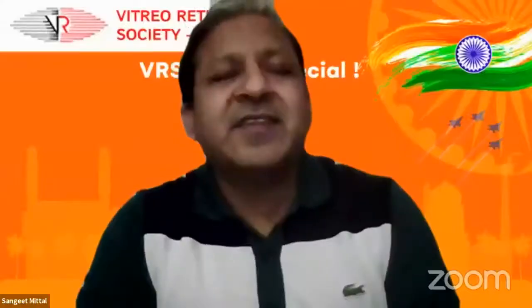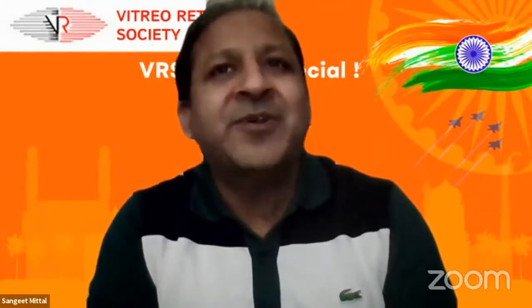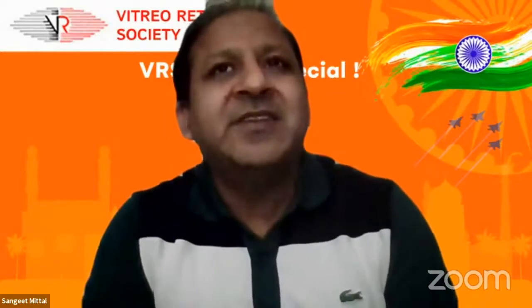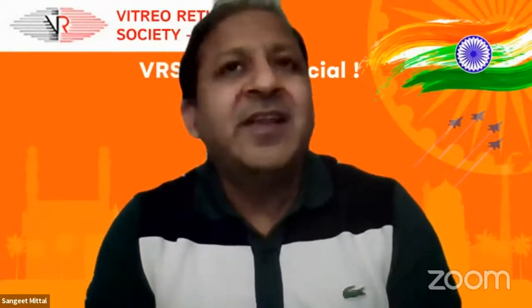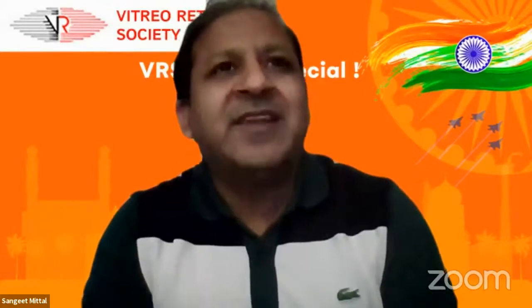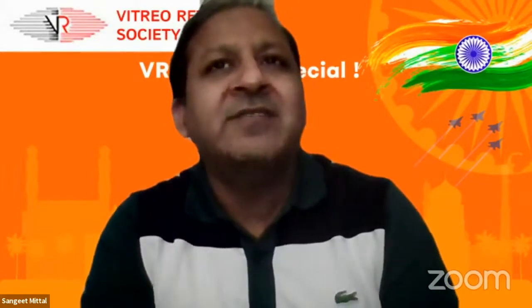In this case, it was very poor contrast. I tried to stain it earlier with the brilliant blue, but could not get a good stain. I used the ICG because it was a very highly myopic eye. There was a lot of myopic degeneration and a scar there. I got a better contrast using the ICG. In earlier cases, I was not sure, so I did the laser around the optic nerve head. But later on, I realized that the laser really does not help in these types of cases. So now I have stopped doing laser around the optic nerve head.